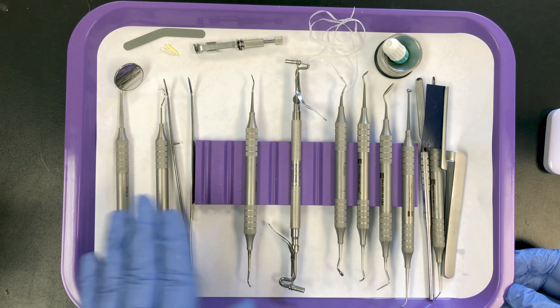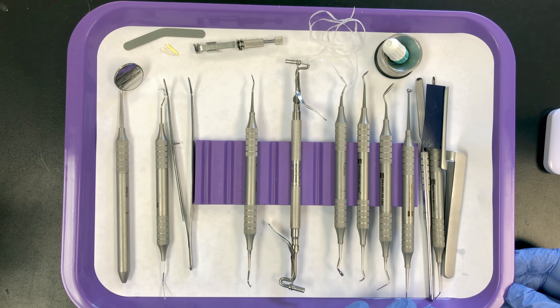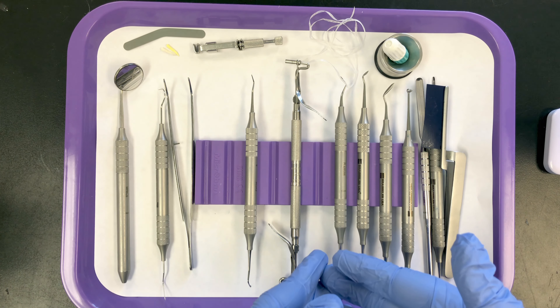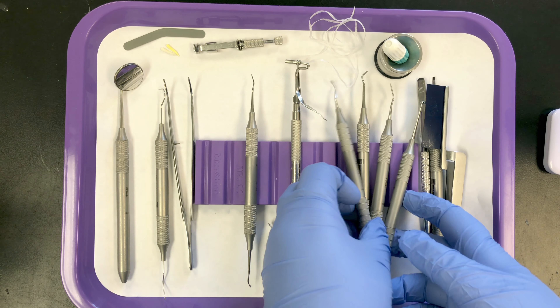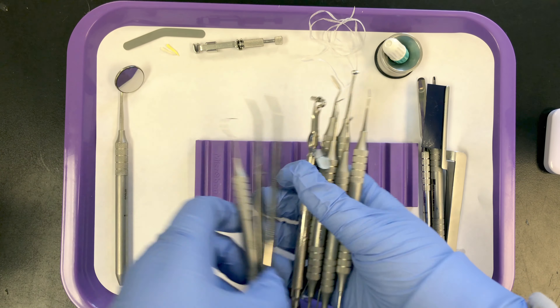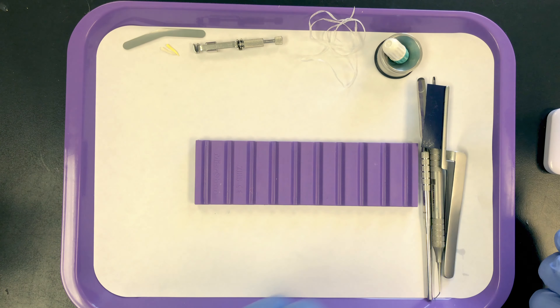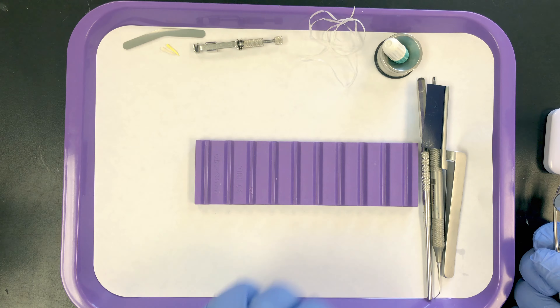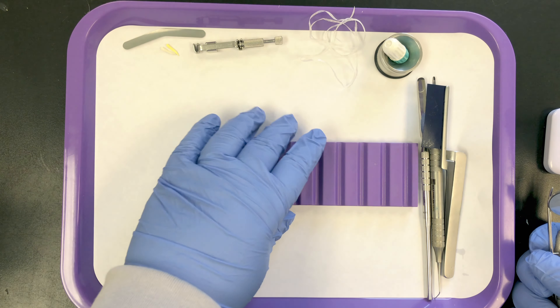From left to right is the order in which the instruments are used. For my students, I scramble up the instruments and they have to get these in the proper order. I'll just scramble up the first nine items. The rest on the tray are accessory items, and these can be in any order on the tray.